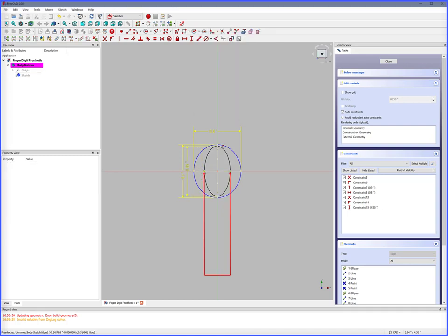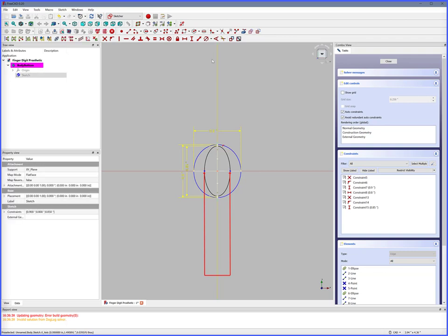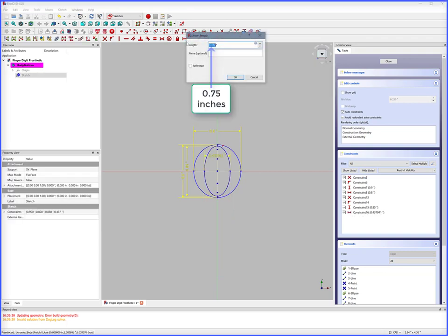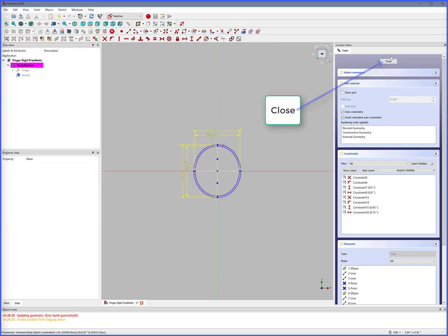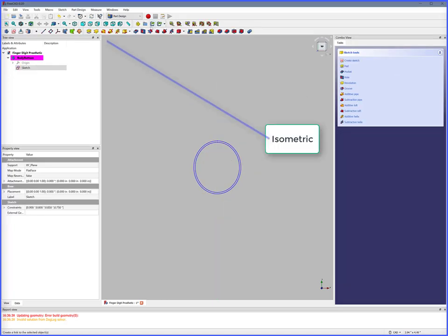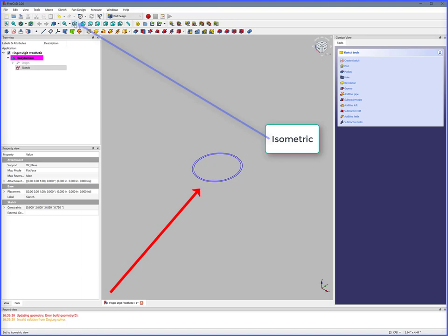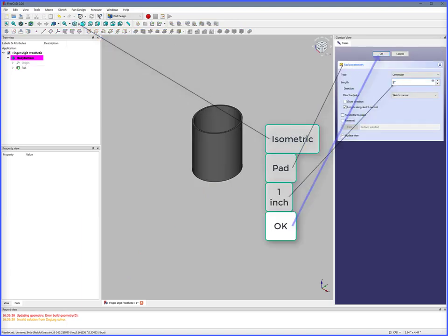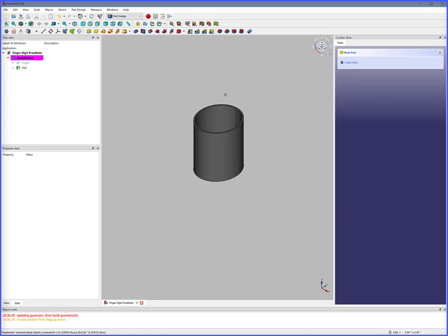Select X max points, Constrain Horizontal Distance — cylinder inside X diameter is 0.75 inches, inside Y diameter is 0.85 inches. Close. Isometric to get a 3D view. Select Pad, set length to 1 inch, OK. We now have an elliptical hollow cylinder.